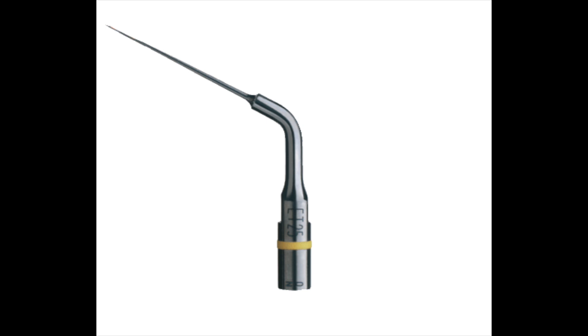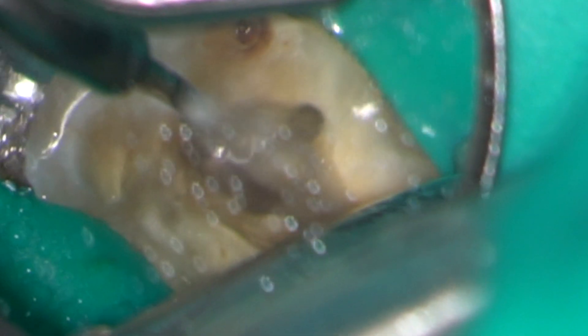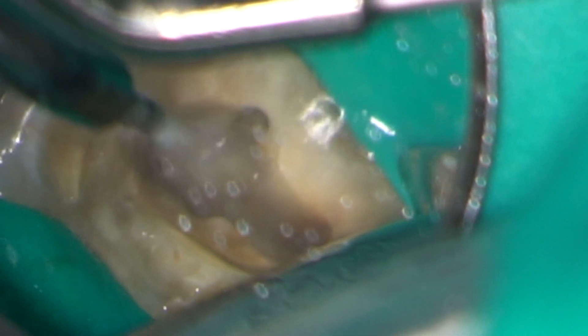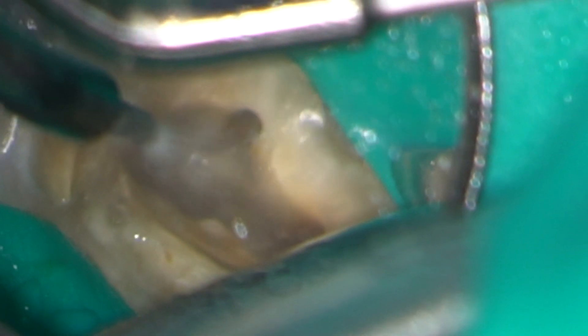I am now using a fine ET25 Endosuccess ultrasonic tip to trough along the isthmus between the MB2 and MB1. Applying low power vibration to the lateral aspect of the silver point loosens it and I can see it move under the microscope.